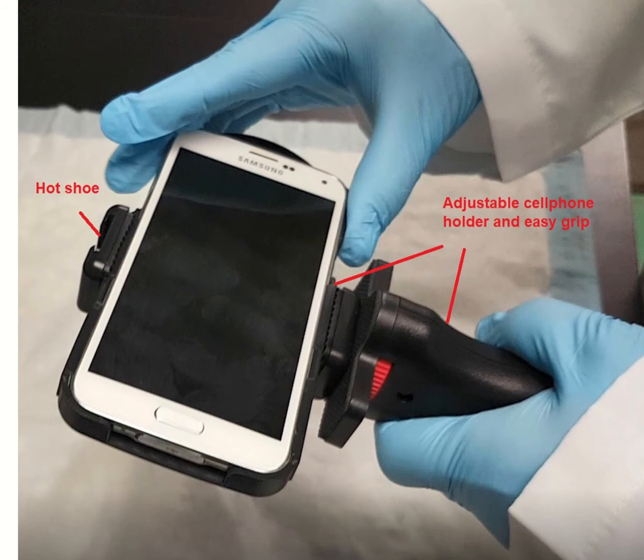It also includes a smartphone holder and an easy grip to stabilize the Forensic Cam, and allows you to easily orientate the smartphone vertically or horizontally for viewing and image capture during your examination.